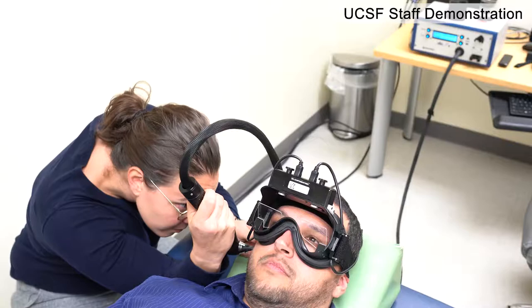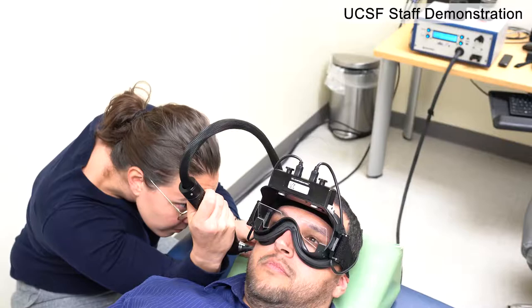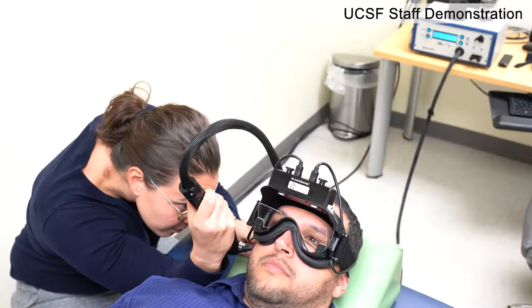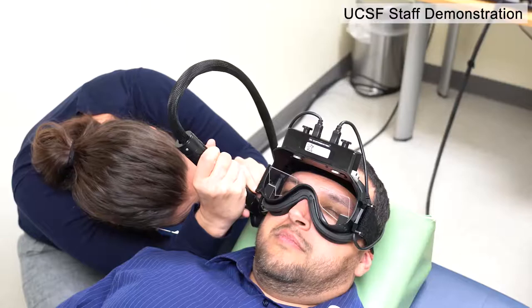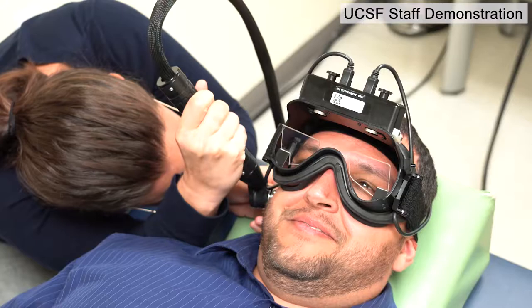The final part of the test is called the caloric test, in which temperature is used to stimulate the vestibular system. Warm or cool air or water will be put into your ear canal and your eye movements will be recorded. One benefit of this part of the test is that it tests one ear at a time, so we can see the differences from one side to the other.